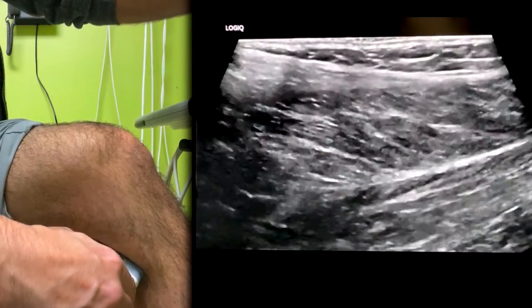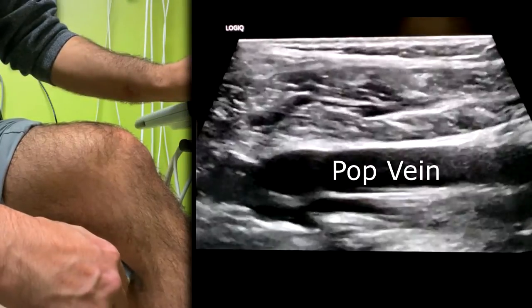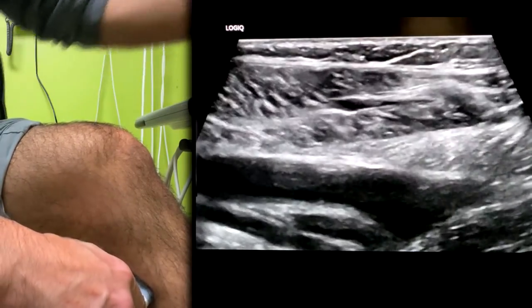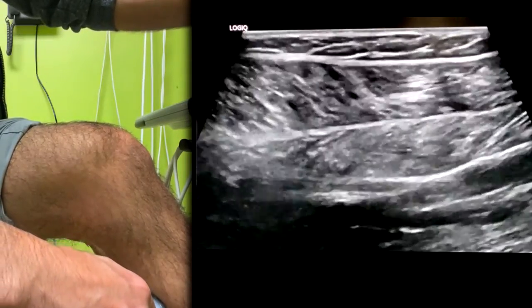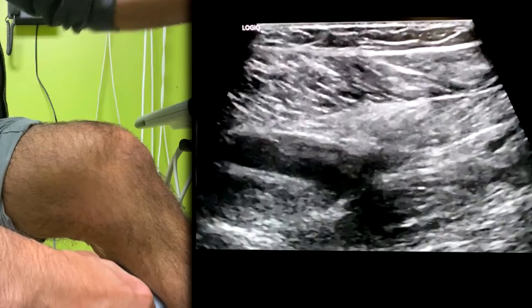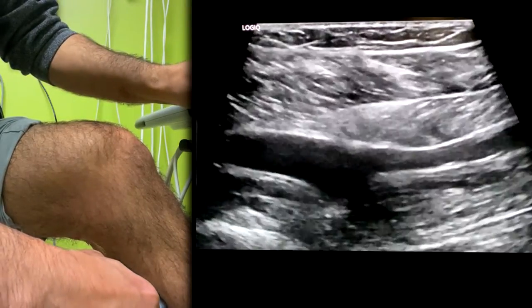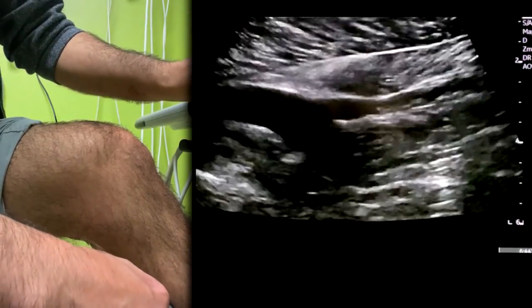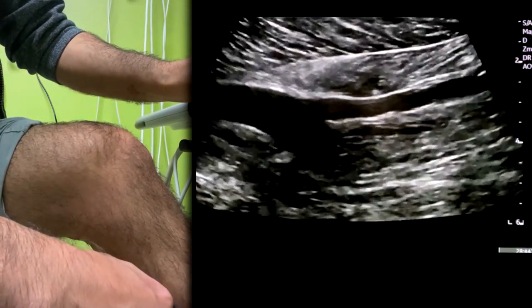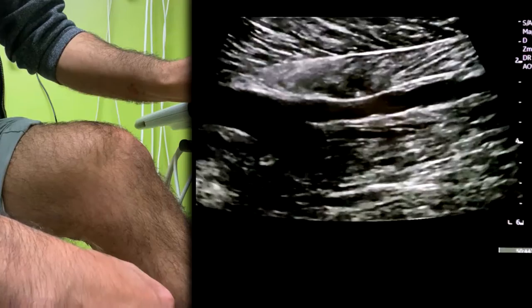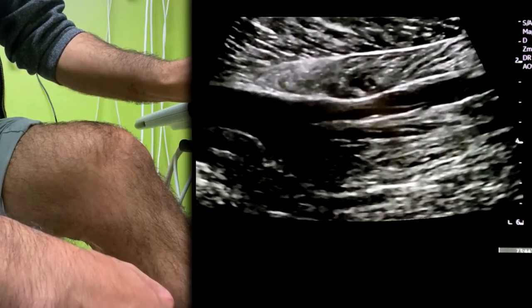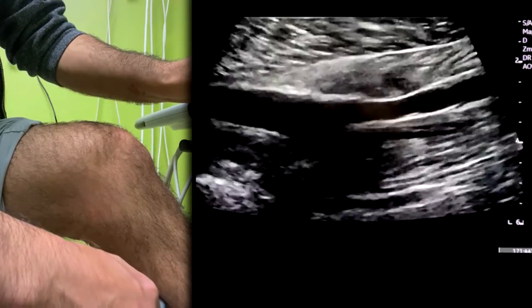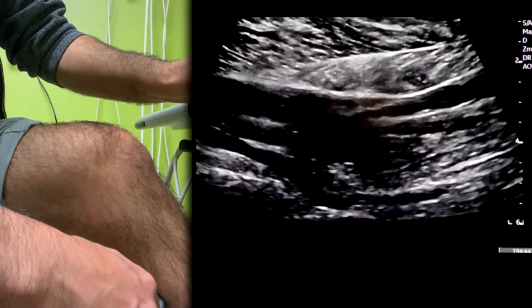Go further down and right there you'll start to see it. So mine seems to be the posterior tibial peroneal trunk, which then bifurcates into the posterior tibial and peroneal vein.